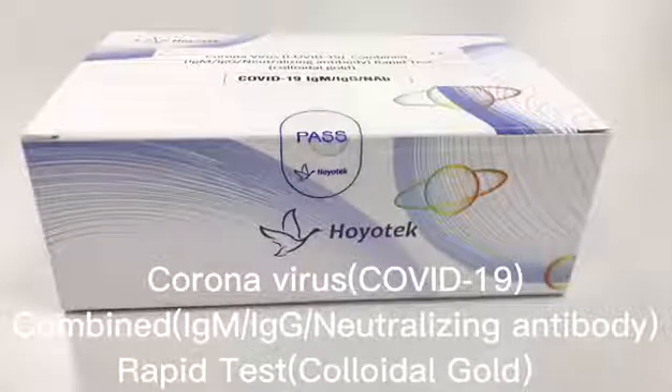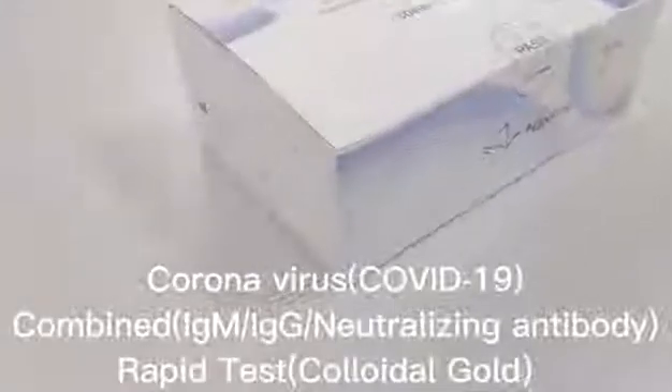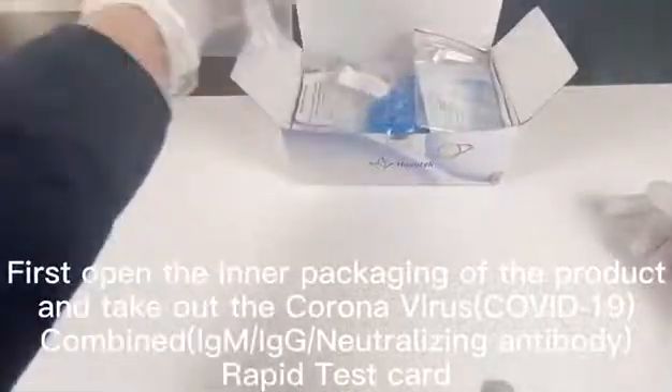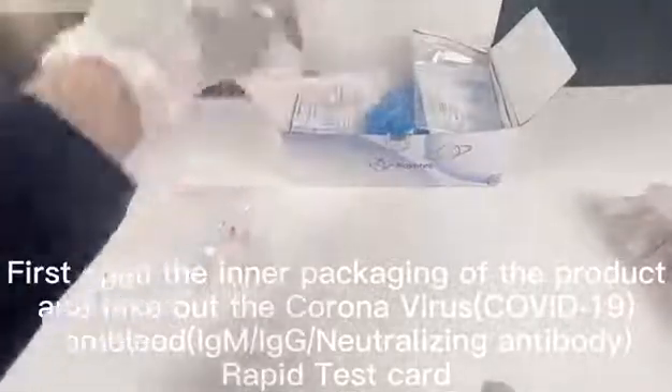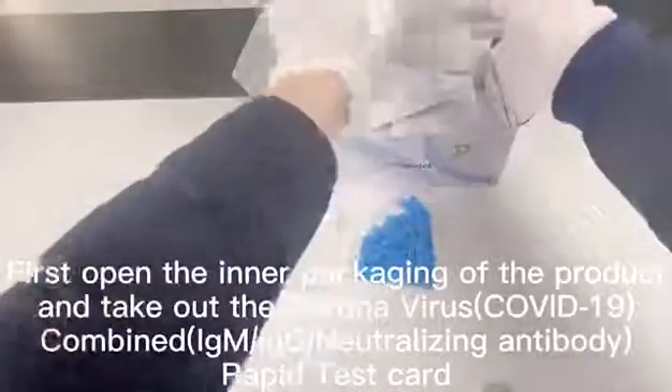Coronavirus COVID-19 Combined IgM/IgG Neutralizing Antibody Rapid Test, Colloidal Gold. Open the inner packaging of the product and take out the Coronavirus COVID-19 Combined IgM/IgG Neutralizing Antibody Rapid Test Card.